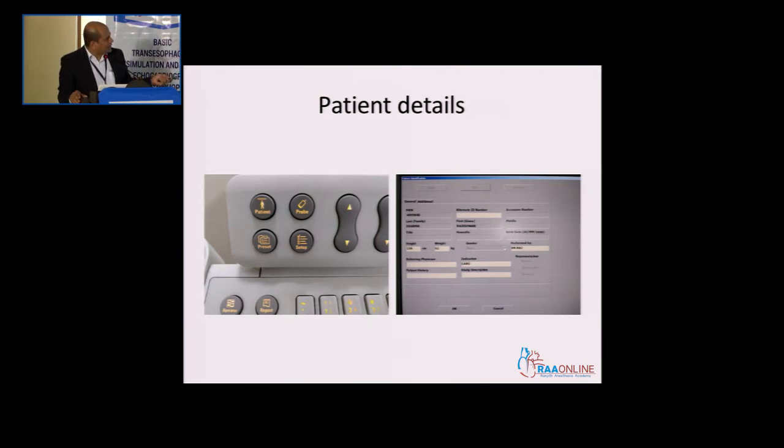There is an option to edit it also. Suppose you are doing a mitral valve repair, and at the end of the case you are developing SAM. You can put SAM also there. So when you try to get cases of SAM at a later date, it's easy to retrieve that information.